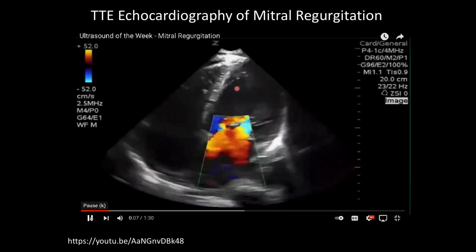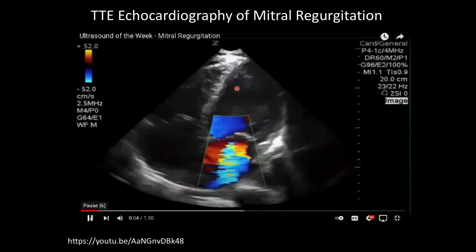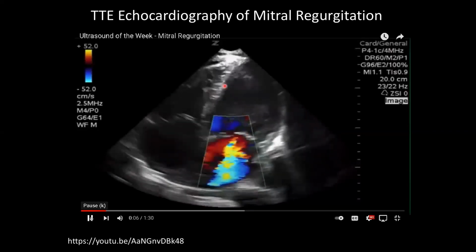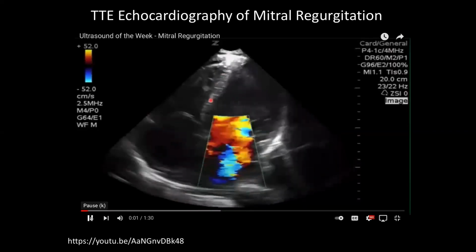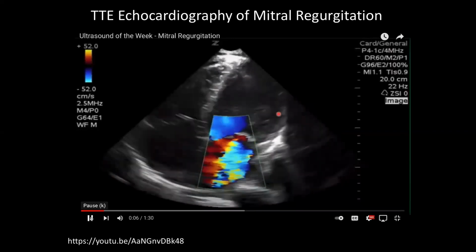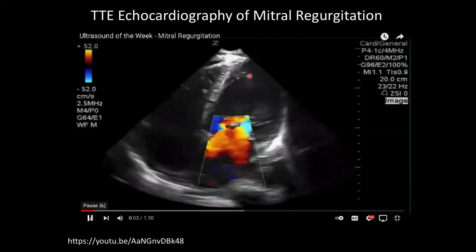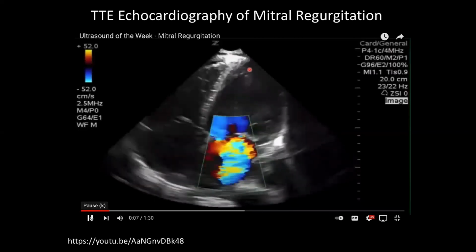And so there are many imaging ways that have been derived from MR, CT, echocardiography to try and measure how much muscle shortening is occurring in that specific location, right? Or in any location. Again, we have some kind of shadow occurring here, so we don't really see this side of the left ventricle that well.